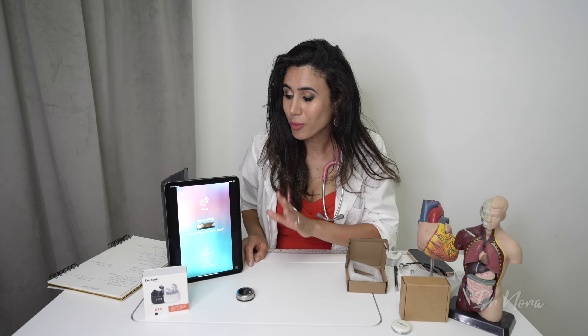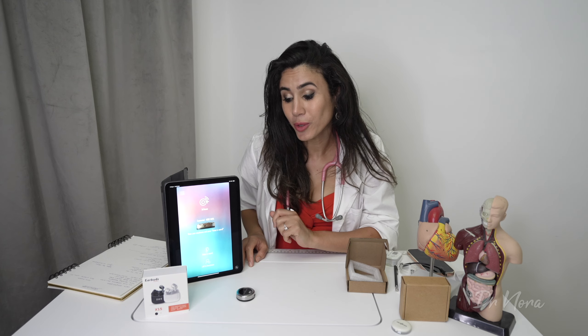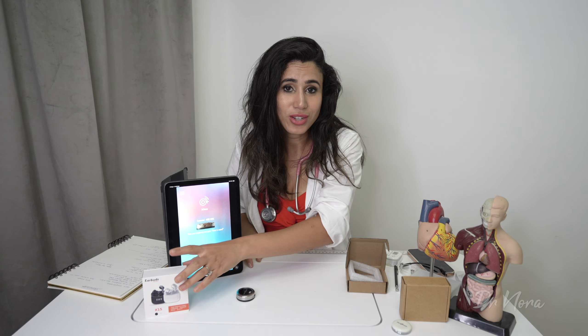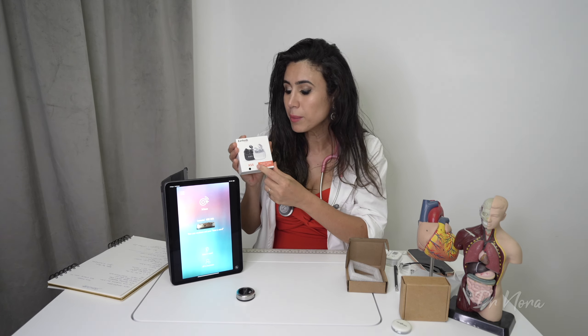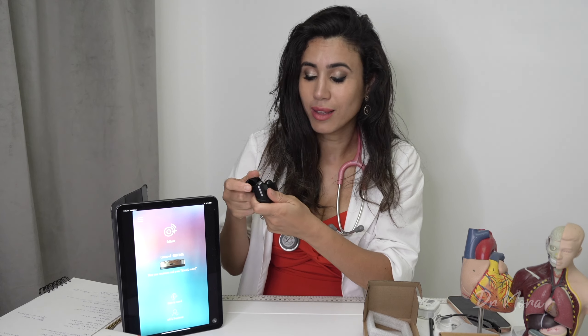Once you've paired your Stemoscope to your mobile device, it's time to listen. You will need headphones, because the app speaker alone may not represent those deeper lower-frequency sounds. The recommended options are over-ear headphones or in-ear headphones with silicone tips — both available as add-ons on their website. I'll pop in the Bluetooth in-ear headphones now and off we go.